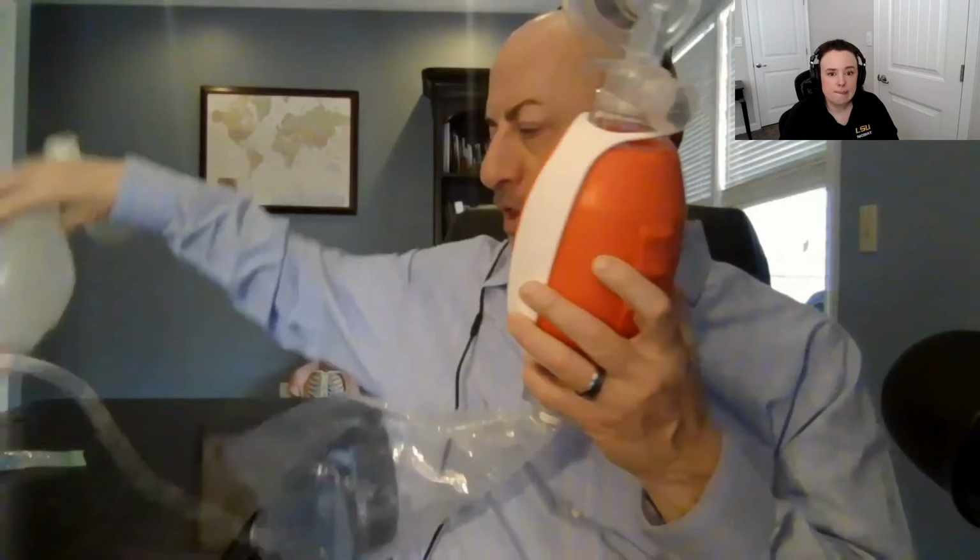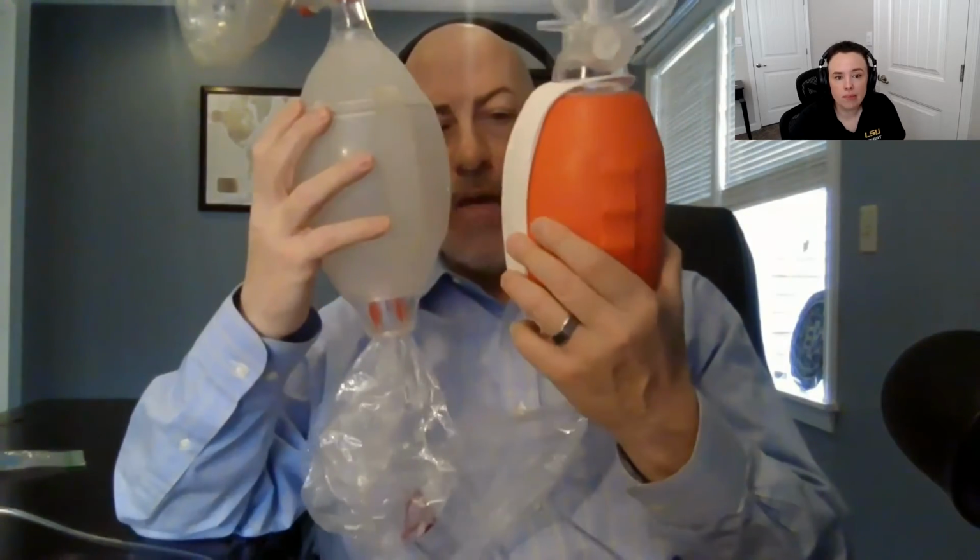So if people keep ordering it and they already have the machines that have the injection molding and everything else, why would they stop making it? The good news is there's a lot of new BVMs coming on the market, and they are a little more money than the plain Jane one I showed you. And they are smaller BVMs. So, for instance, this is something that came out a couple of years ago, and you can sort of see the difference. This one is 1200 mLs, whereas this one's 1500. This one is 1000 mLs versus 1500 mLs, right? So if you're using a BVM that theoretically has a maximum of 1000, you're much less likely to overventilate them too much. So that's the volume issue.